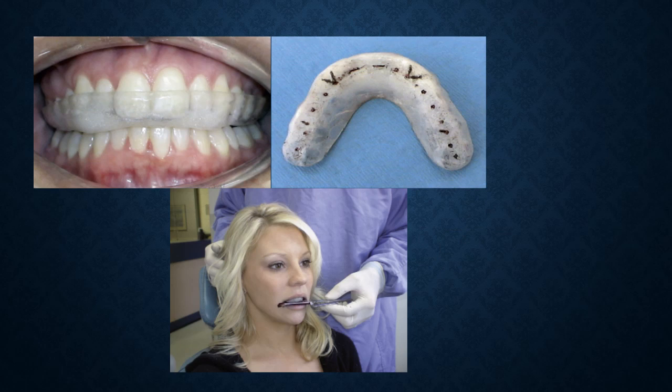You check the occlusal contact at centric. It will be on all the flat surfaces, and also you check the guidance by the anterior teeth during protrusion, and the guidance by the canine during working, and also you may eliminate any interferences during protrusion and movement to the working side from the right and left.